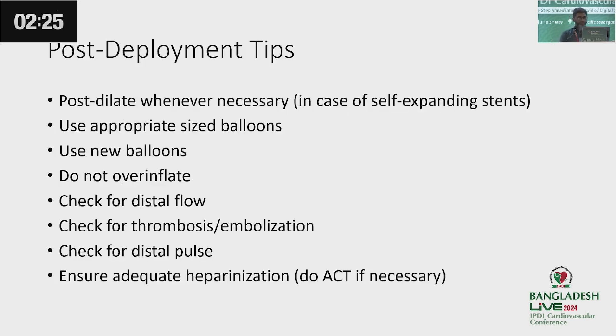Post-deployment tips. Post-dilate whenever necessary. Usually we do post-dilatation in case of self-expanding stent. Use an appropriate size balloon. Use a new balloon. Sometimes we use a balloon after resterilization. Do not overinflate. If we do overinflation, there is a chance of rupture or perforation.